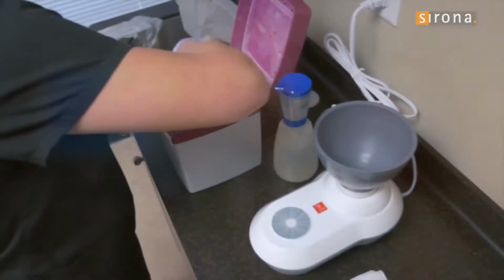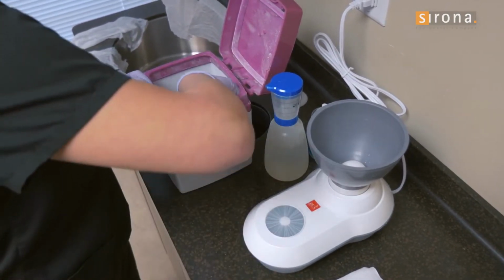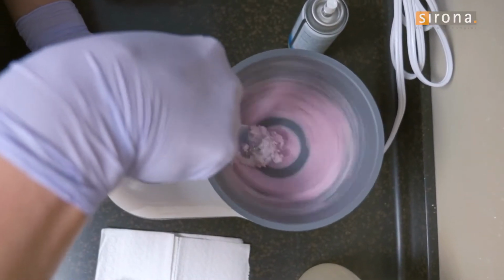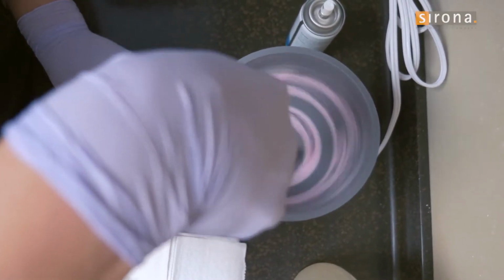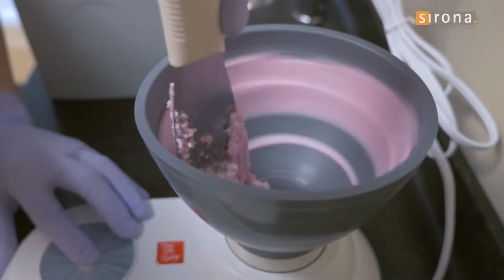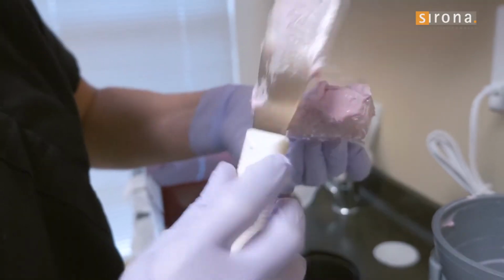In a multiple-visit crown and bridge case, typically the first thing that we do is take a pre-impression for the temporary. Now this can be taken with alginate, although many offices will use polyvinyl siloxane because they want to be able to hold on to that impression in case the patient breaks the temporary or loses the temporary. And of course, this pre-impression, if it's polyvinyl, can cost $15 to $18 depending on what you're doing. But since there is no temporary in the single-visit dentistry workflow, we do not have to take this impression at all.